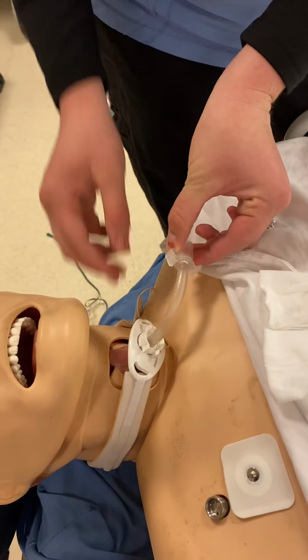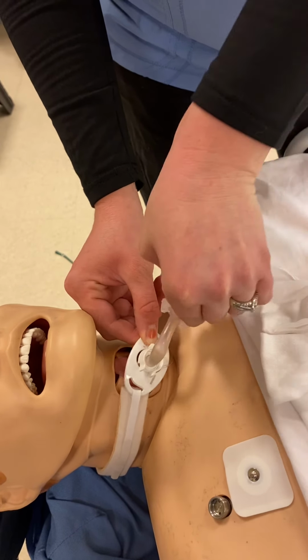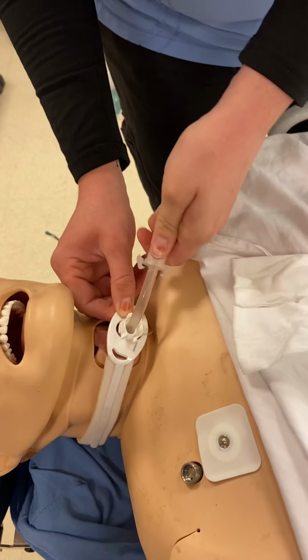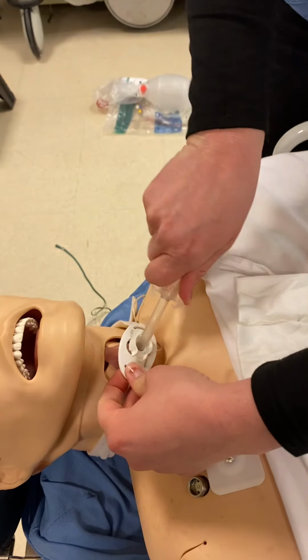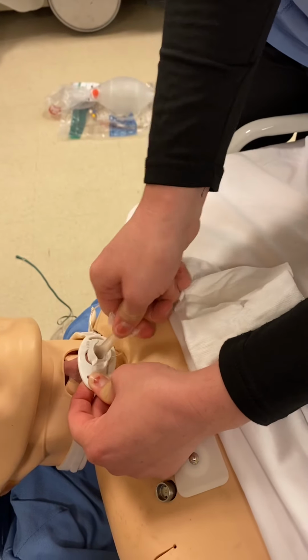Putting it in at an angle, holding onto that flange, and then just kind of twisting down in. And I promise it goes in a lot easier on a live patient. And it's preferable to change and get a new one, correct, but we're just running low on supplies. So we might have to clean them.